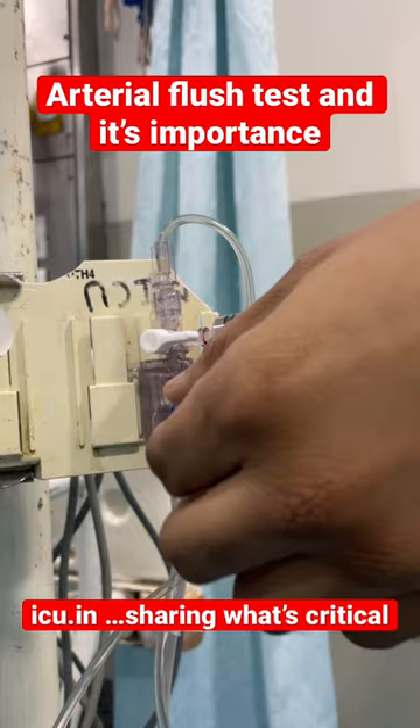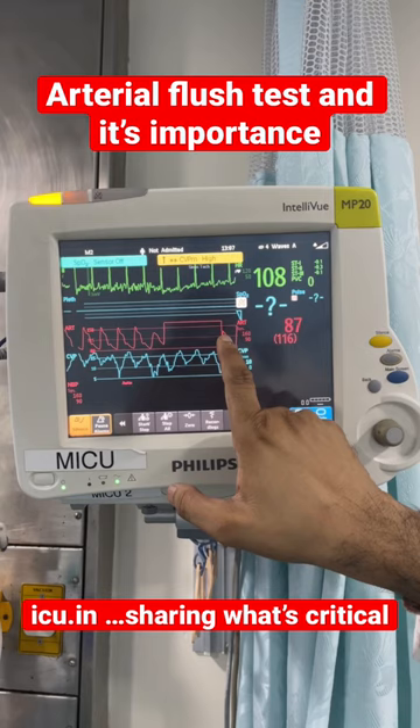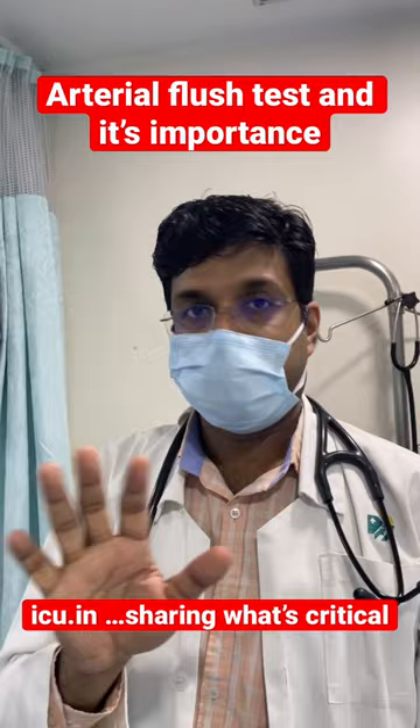This is your arterial trace. When I pull the arterial flush valve and release it, there are some oscillations. I pull it again and upon releasing there are some oscillations. These oscillations are important — if they are two in number, that is fine.